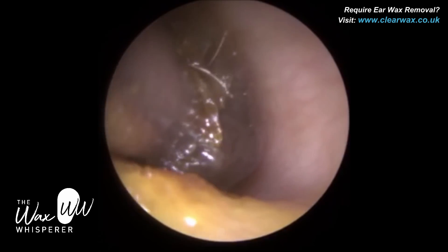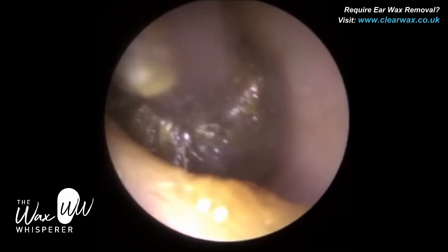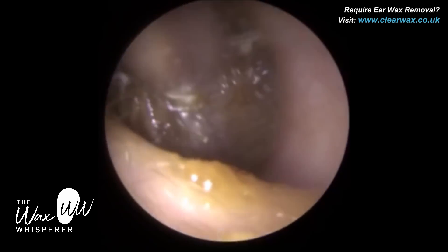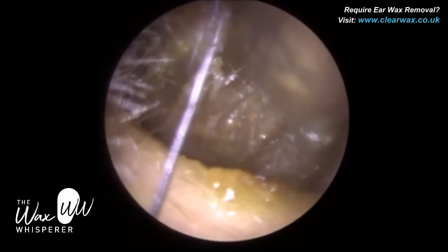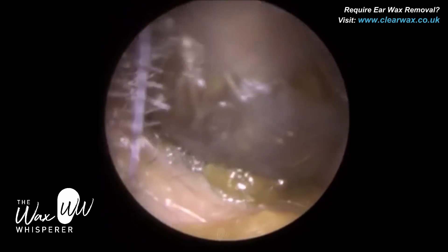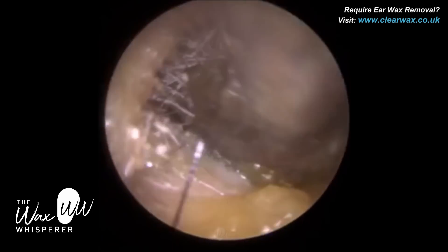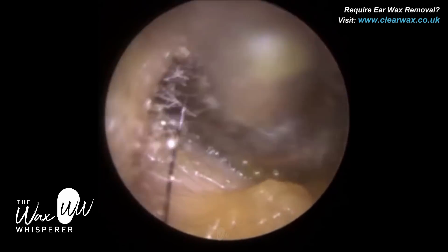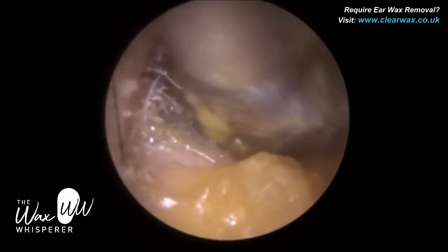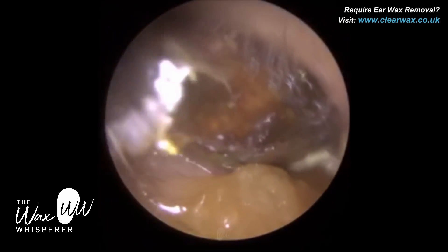You can see the keratin is now engulfed around this plug of wax, but it's not clarinetting — not emitting any loud high-frequency squeals. I've managed to almost trap the keratin around the wax so it's not flapping violently at the tip of the suction probe. Clarinetting happens when dead skin keratin flaps backwards and forwards violently at the suction probe tip. But if you get the keratin trapped into the probe so it's not flapping, you don't get that clarinetting.